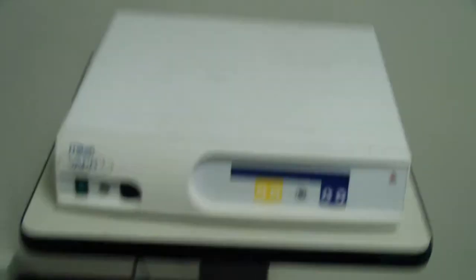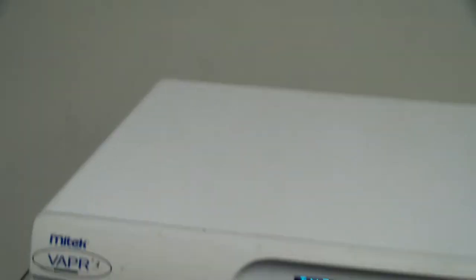This is DCSP Medical. We're looking at a Mitek ESU. It doesn't have any hand pieces or a foot switch.